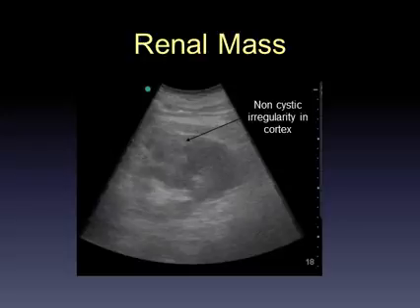I would really discourage you from making any conclusions about masses or neoplasm in a patient whom you suspect there might be a possibility based on just a bedside scan. If you are thinking that, then more comprehensive imaging is probably warranted.